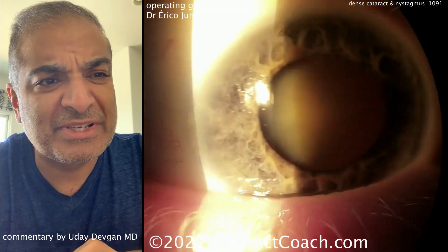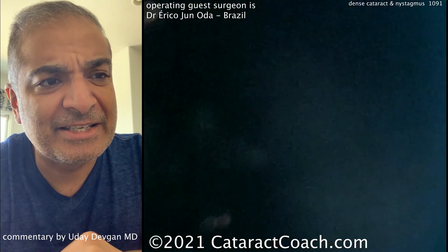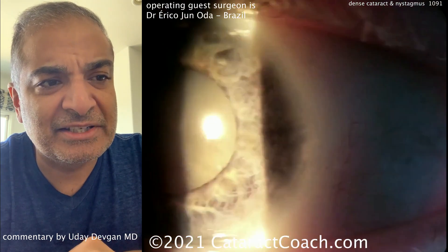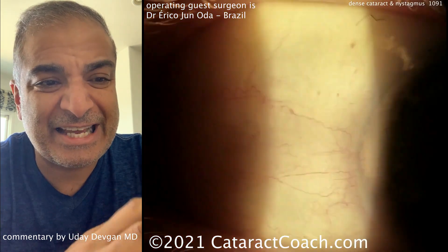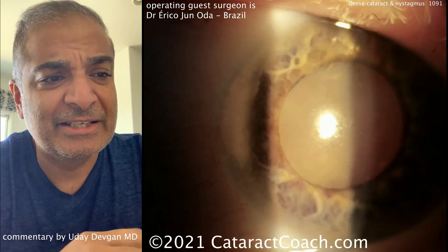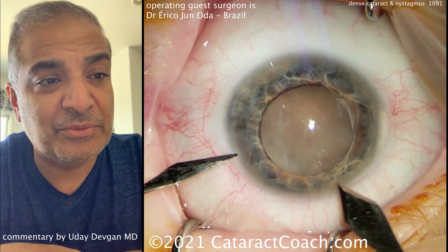You can see that extreme nystagmus and very dense cataracts. You can see the pale eyelashes and the lack of pigmentation — this is ocular albinism. You can see extensive, very dense nuclear sclerotic cataracts. So we're going to watch him do this expert level cataract surgery and see what we can learn.